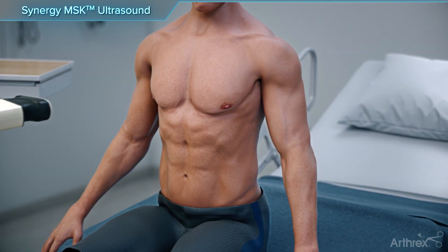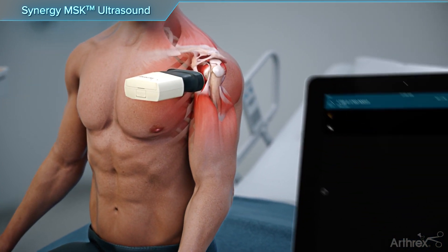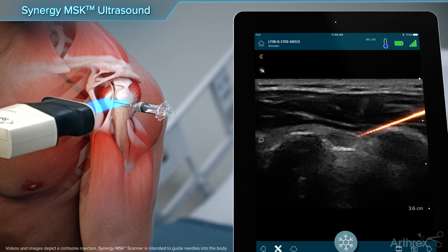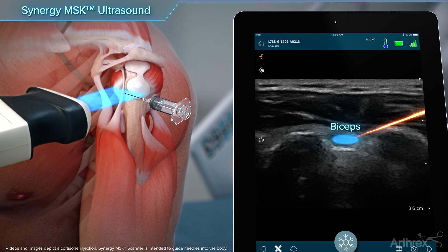To visualize the long head of the biceps in short axis, the arm is relaxed in a neutral position with the hand supinated. The scanner is positioned over the biceps tendon and, from a lateral direction, the needle is inserted into the synovial sheath in plane with the scanner.